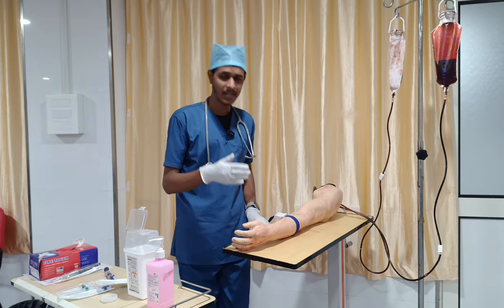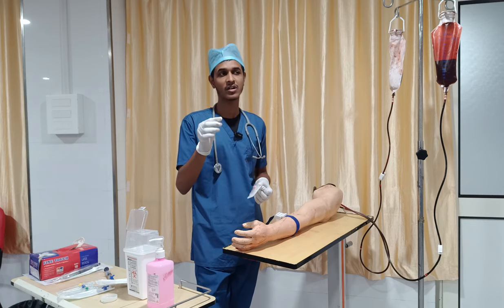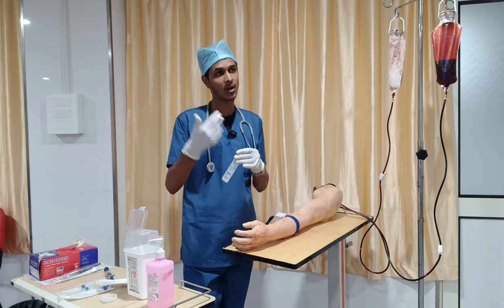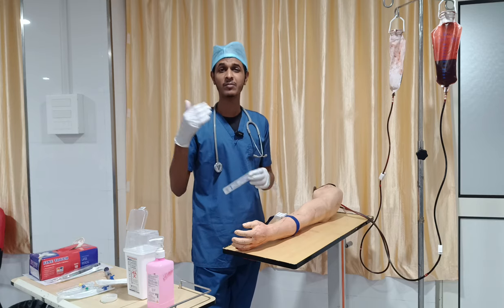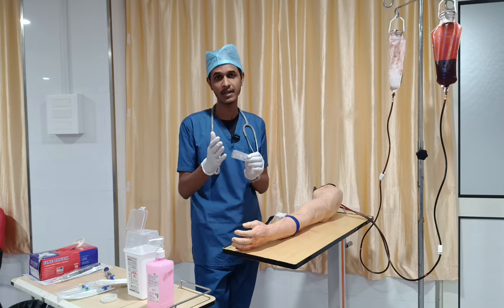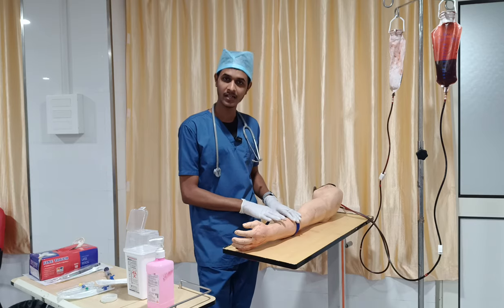One more thing, while inserting the cannula, the vein should be palpable. It should not be hard. If previously you pricked, or if the person has been on some antibiotic medication for a prolonged time, there can be phlebitis. Or if the person has illicit drug usage, there also we can feel some phlebitis or hardening of the vessel. If you feel that hardening of the vessel, then you definitely have to avoid that vein. By this time I can see the engorging of the vein.